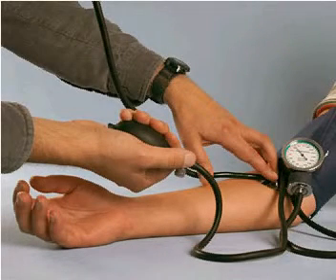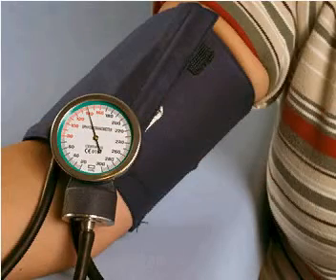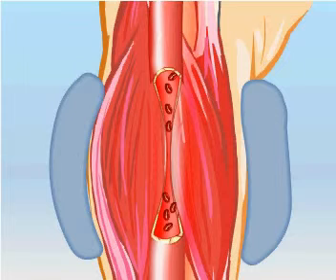The cuff is usually placed on the arm and inflated with air under the control of the pulse below the cuff with a stethoscope. At the same time, the pressure inside the cuff is measured by a manometer connected to the cuff. The cuff grasping the arm is filled with air, which finally closes the blood flow through the artery surrounded by the cuff. It is completed when the sound of the pulse below the cuff stops.